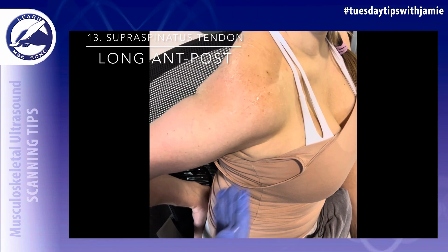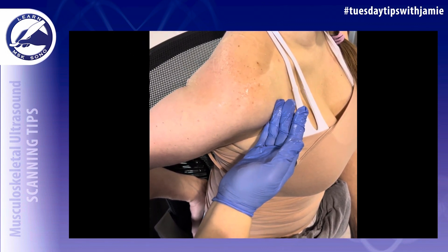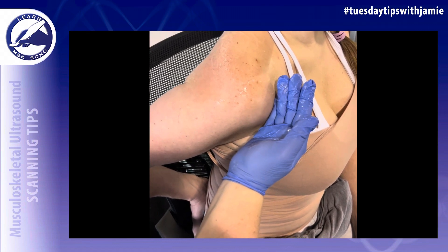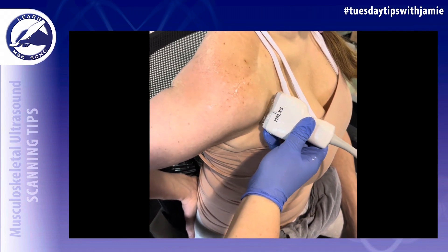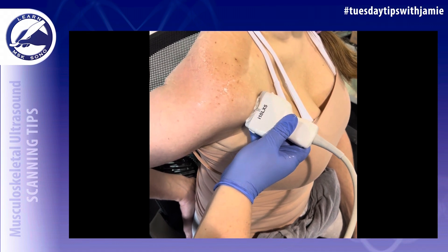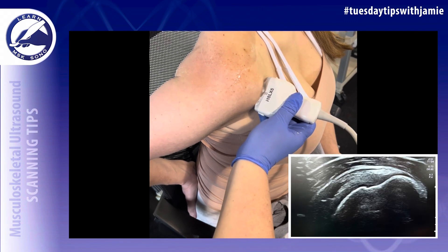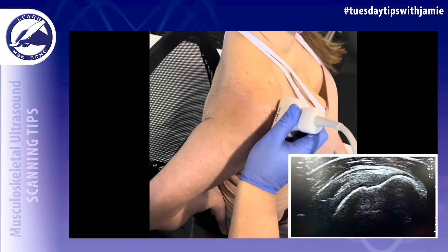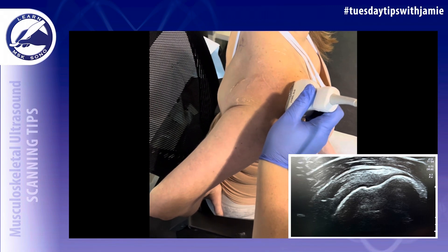For the supraspinatus tendon, use the deltopectoral groove as your landmark — the crease in the shoulder. Place the transducer with the notch up at the deltopectoral groove, then sweep posteriorly past the long head of the biceps tendon to image the supraspinatus tendon in the long axis from anterior to posterior, maintaining the same angle throughout. Label this image 'supraspinatus long anterior to posterior.'